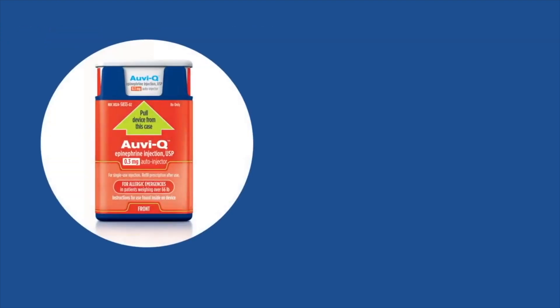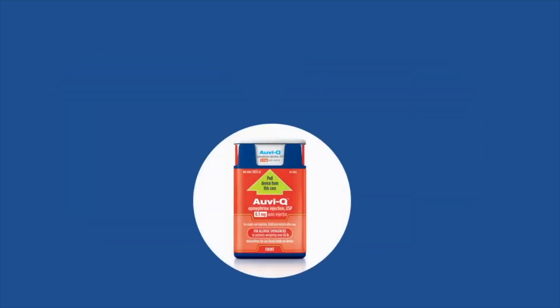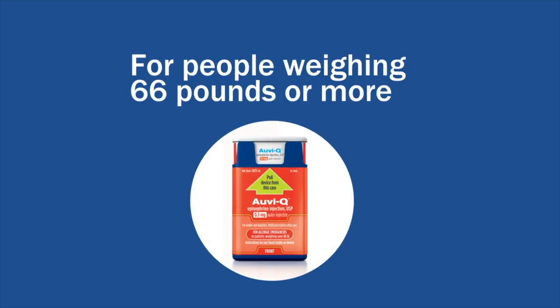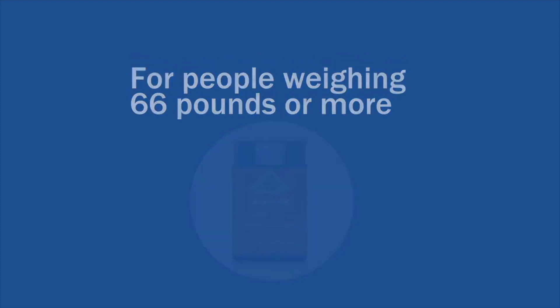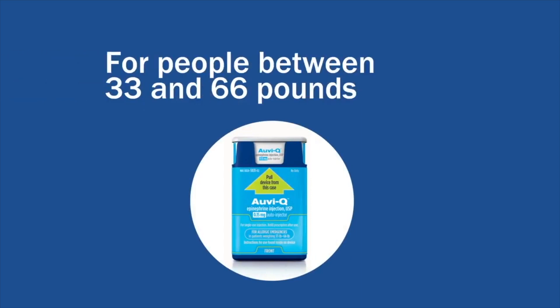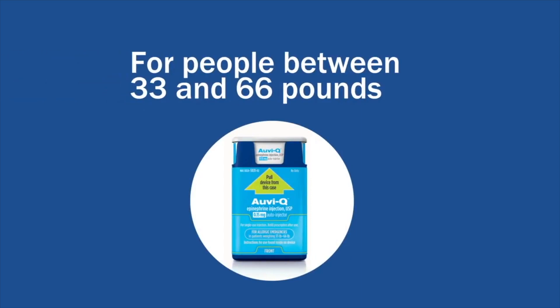OVQ has two epinephrine auto-injectors. OVQ 0.3 milligrams has a red label and is for people who weigh 66 pounds or more. OVQ 0.15 milligrams has a blue label and is for people who weigh 33 to 66 pounds.